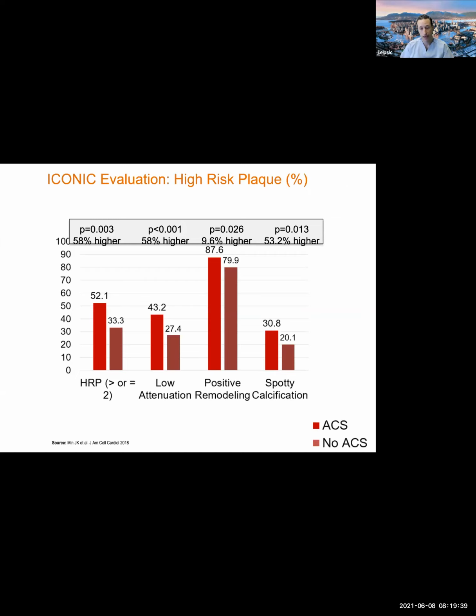is real. Now, there's been a whole compendium of data that have been shared with us over the last decade, starting with Sadako Motoyama and Jagat Narula's work in 2007, highlighting that the same features identified on IVUS that helped identify patients at risk, so-called positive remodeling and low-density plaque, are predictive of downstream events. We found the same with CT. And in fact, CT has, I think, expanded our understanding of this by really highlighting a couple of things.